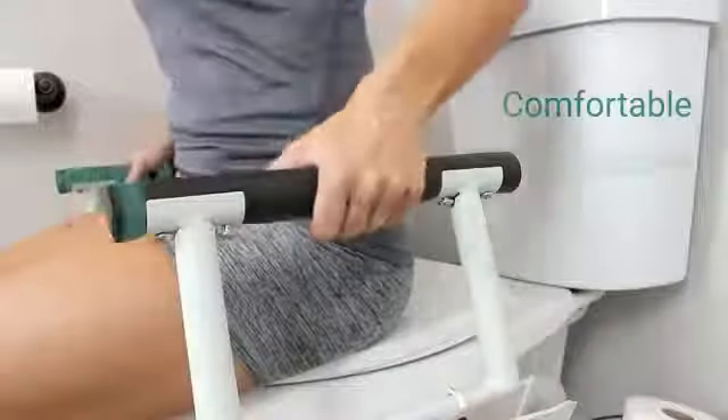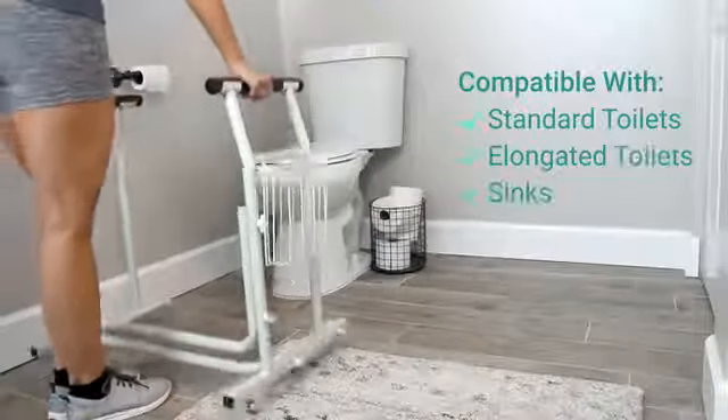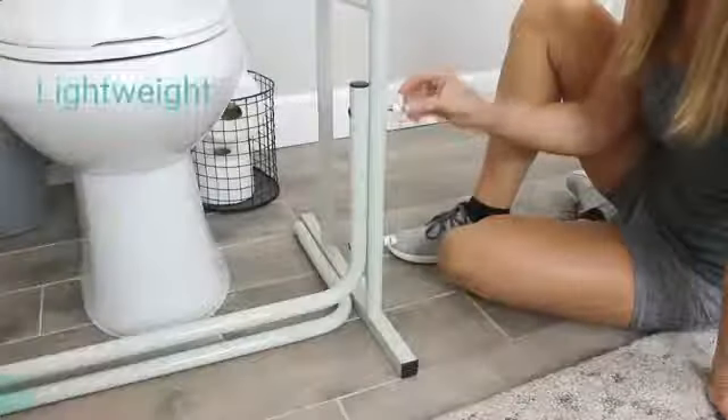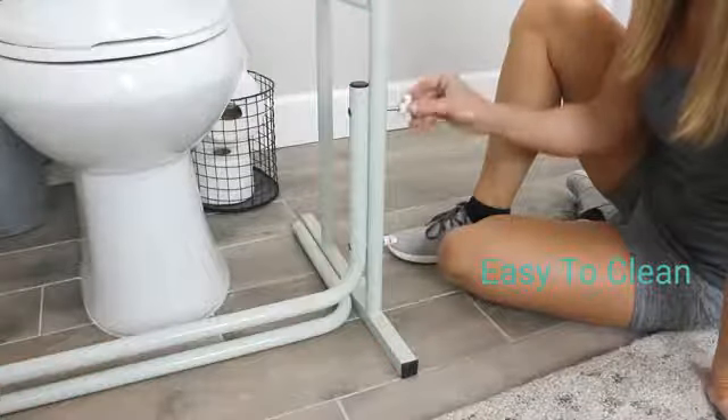Comfortable padded handles provide a secure, pain-free grip. The freestanding aluminum rail is compatible with standard and elongated toilets as well as sinks. Lightweight, corrosion-resistant material is easy to clean, and the handles are removable for convenient storage.